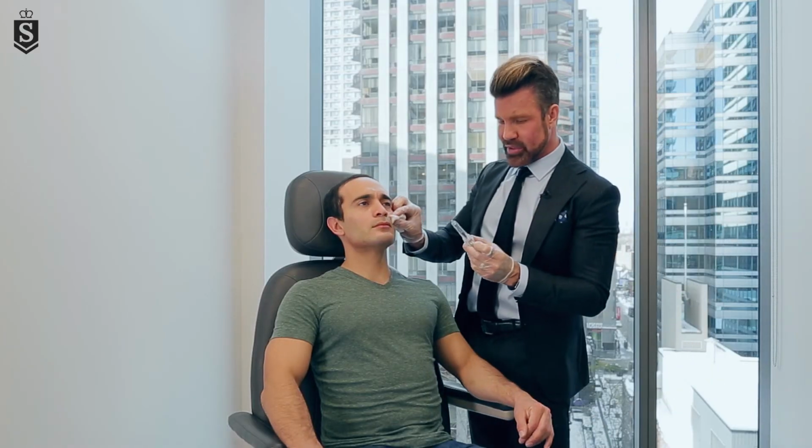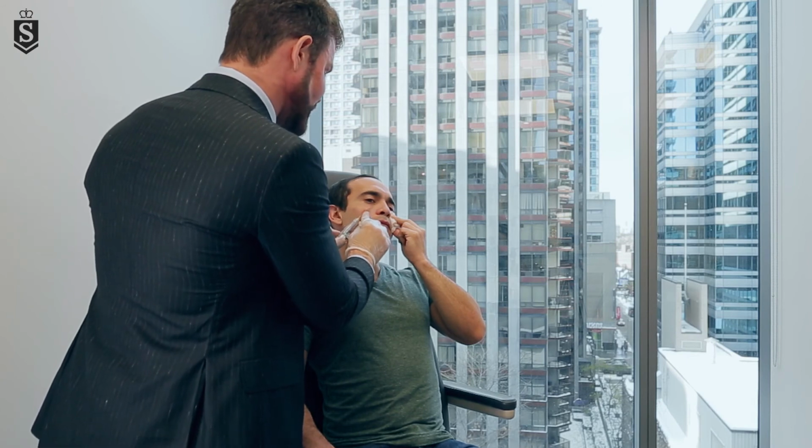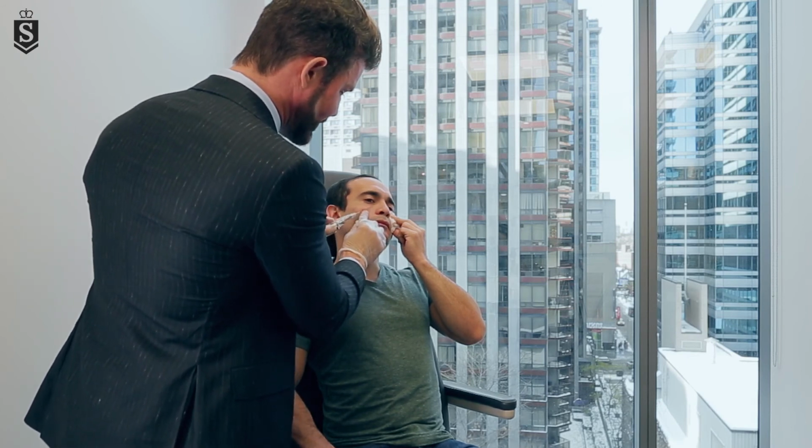around the lower eyelids. And here again, I'm using the injectable pen for control and precision, and also for, keep your eyes open. And you can see exactly where I am here. I'm actually quite deep. We want to be deep. This product is awesome. It's going to last him a good 9 to 12 months here before he could conceivably do this again. So we're going to use a little bit of a balm just to smooth things out.